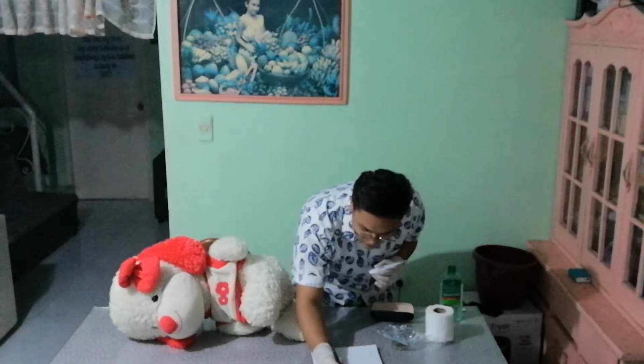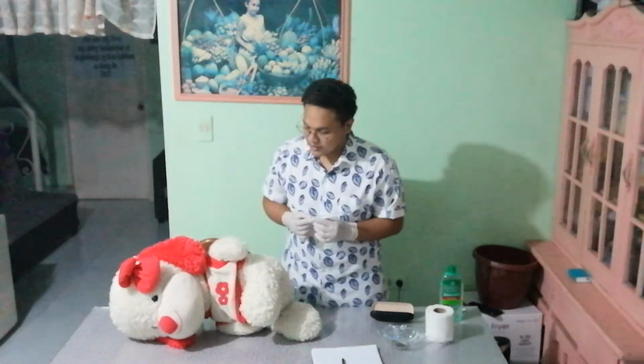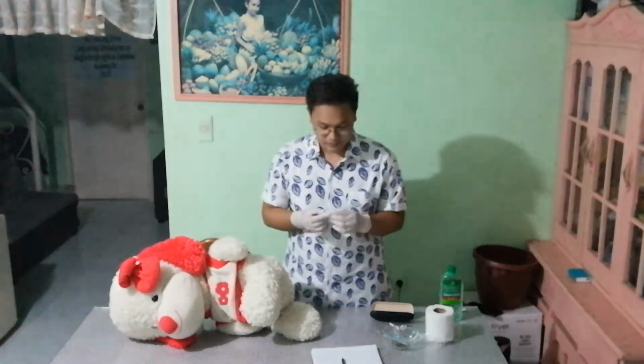Ma'am, you've got a 36.5 degrees Celsius rectal temperature, and that is still in the normal range of body temperature. So for our 8th step, we need to dispose the probe cover by holding the probe over an appropriate receptacle and pushing the probe release button.